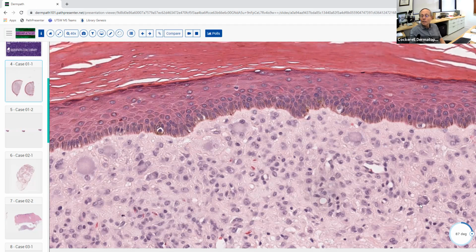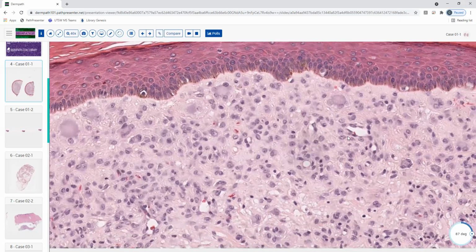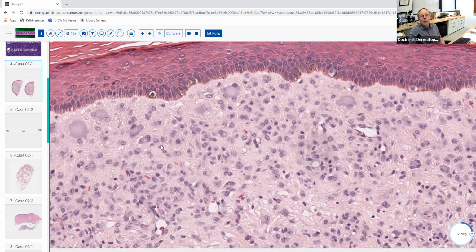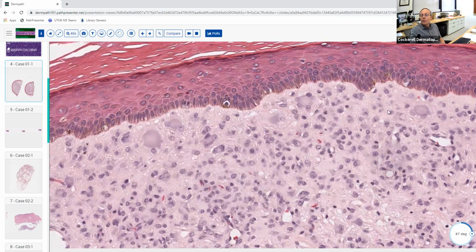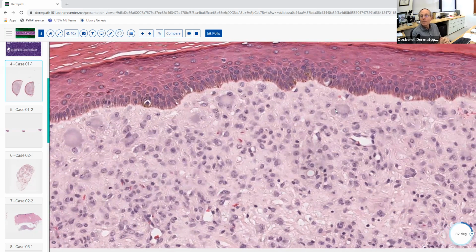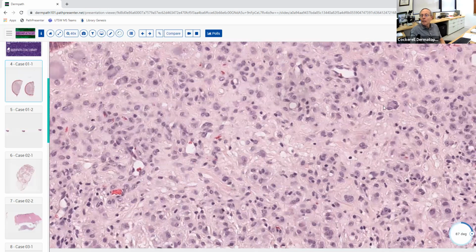So what kind of giant cells are we looking at here? I think they're Touton giant cells. Yeah, these are Touton giant cells. These aren't the world's best formed Touton giant cells, but they are Touton giant cells. We get a wreath of nuclei surrounded by this pale cytoplasm. We'll call them two-tone giant cells, that's the way to remember it. That's characteristic. And what are these other cells here besides these multinucleated ones? What are these other cells in the background?